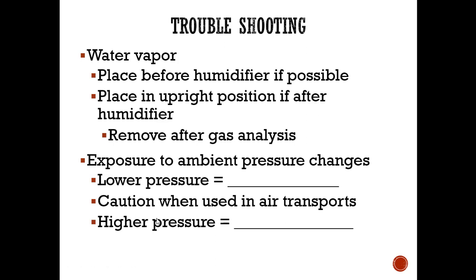Some of the other things that can cause false readings. So let's say your FiO2 analyzer is working, you're not having an issue with the galvanic fuel cell, you're not having an issue with the battery. Water vapor, very commonly, is an issue for both our CO2 and our oxygen analyzers. Having water vapor in the lines, having water vapor on the sensor can make for kind of wonky readings or just make it error out.